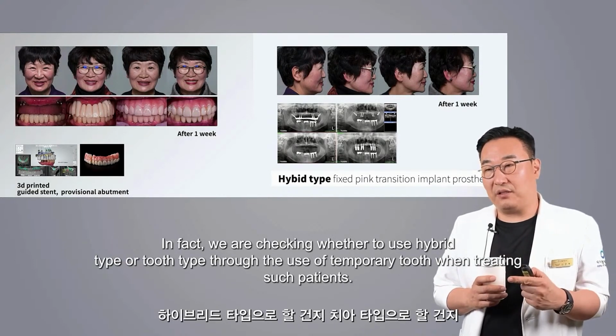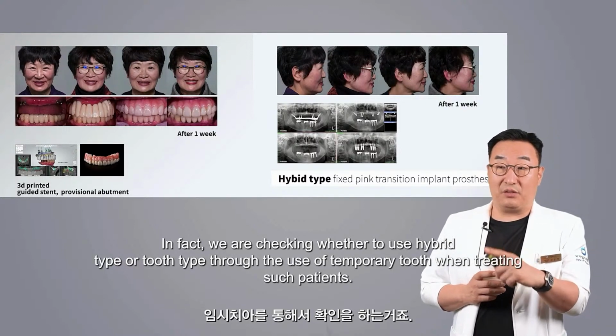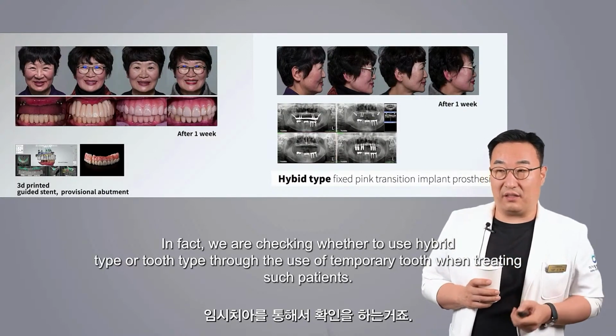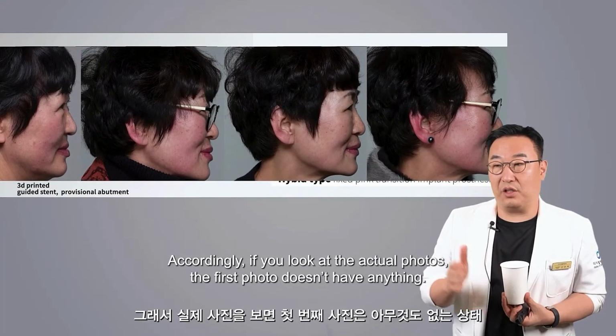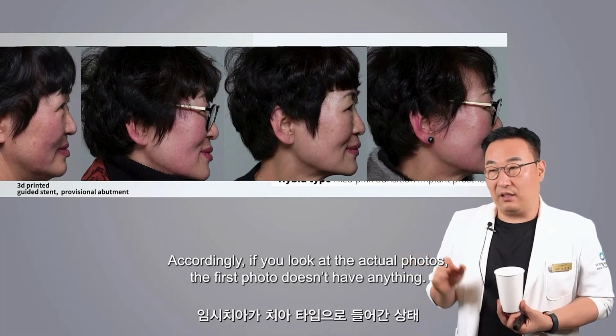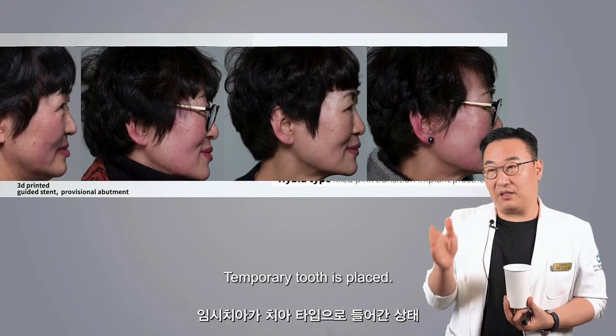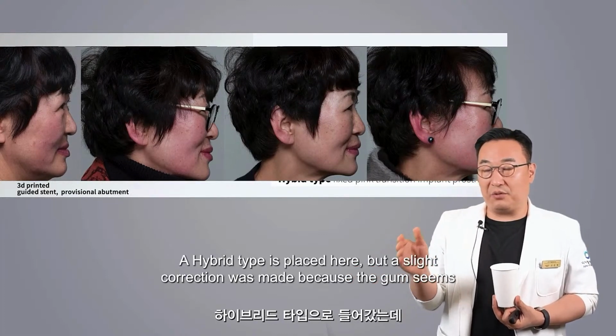In fact, we are checking whether to use hybrid type or tooth type through the use of temporary tooth when treating such patients. Accordingly, if you look at the actual photos, the first photo doesn't have anything. Temporary tooth is placed. The next is where a hybrid type is placed.